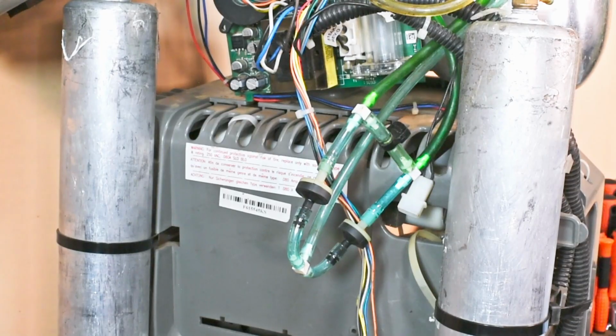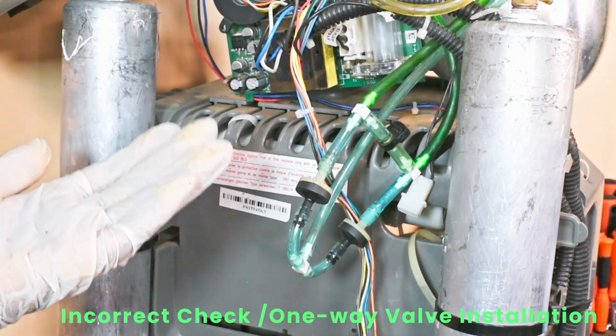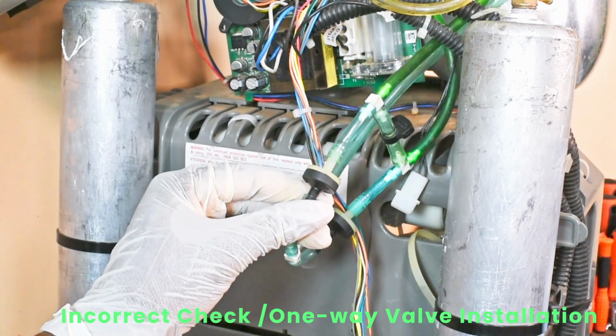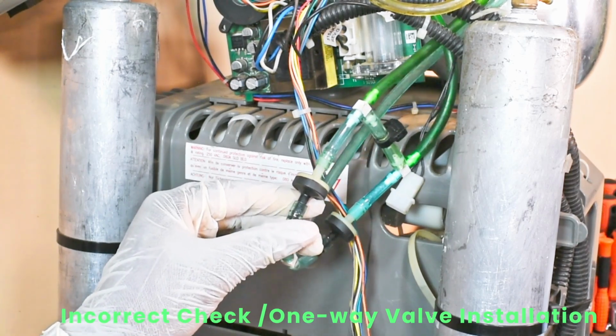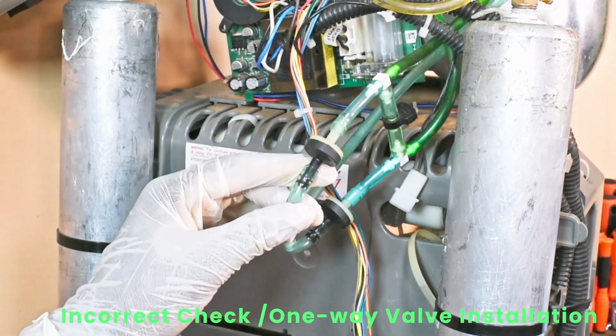performance drops. In other oxygen concentrator models, for example, this DeVilbiss 525, incorrect installation of a check valve could also cause low oxygen purity. And this is because a reversed check valve can cause the backflow of oxygen.